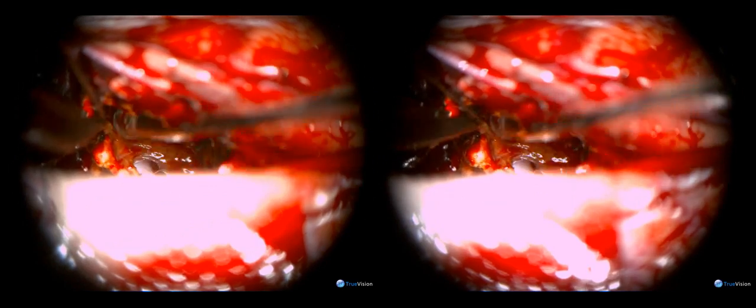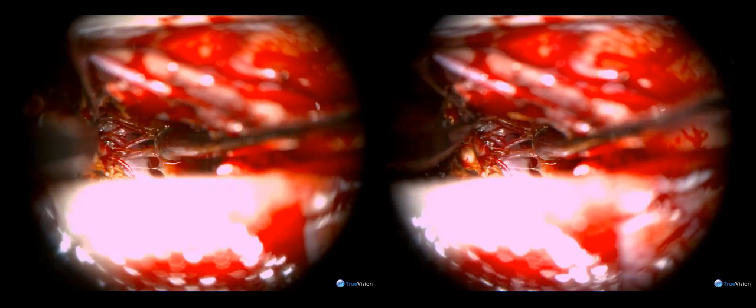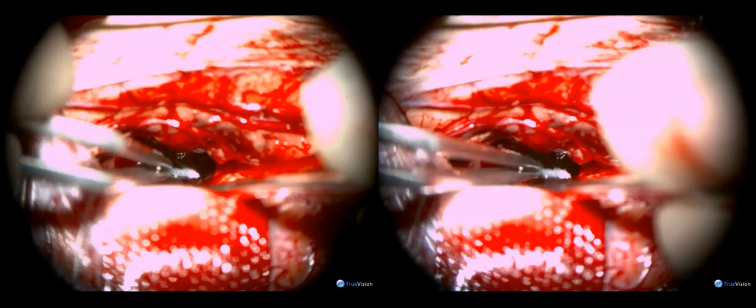You can see a glimpse of the middle cerebral artery through the depths of the resection cavity. This shows the extent of our reach all the way into the sylvian fissure on the contralateral side. A cottonoid is being placed over the middle cerebral artery to protect the M1 segment and its lenticulostriate vessels.